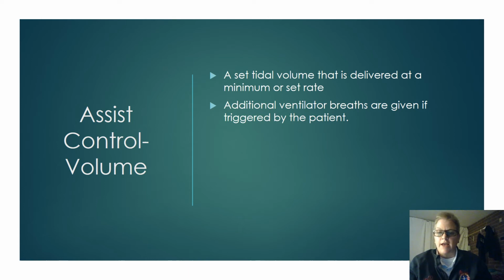Our patient that is not controlled with sedation and analgesia can just draw a breath, start to breathe, and it gives them that 550 tidal volume that we set, and it could cause stacking of breaths.